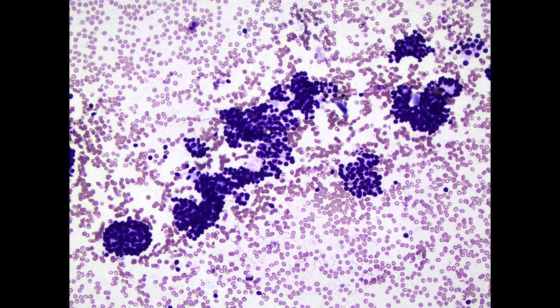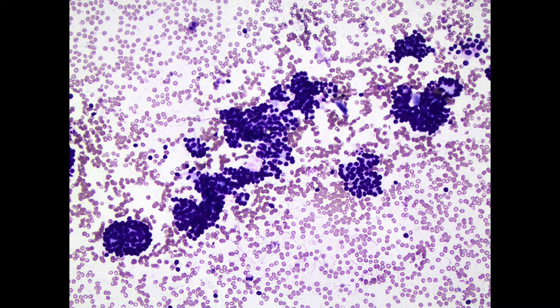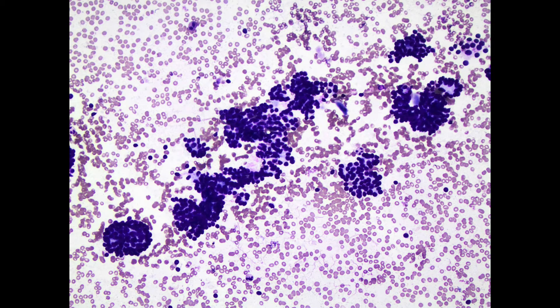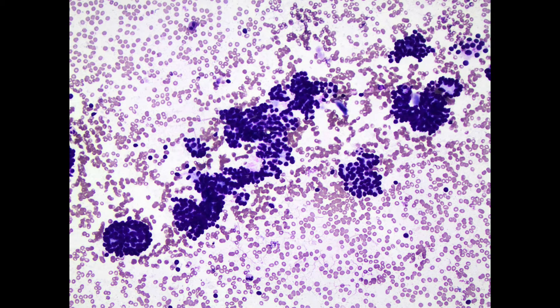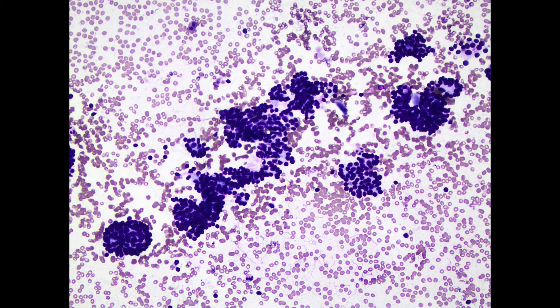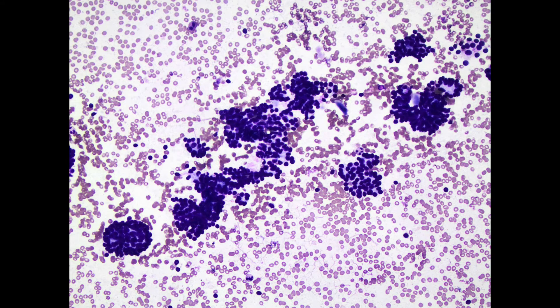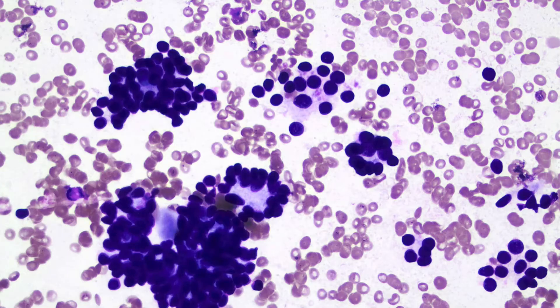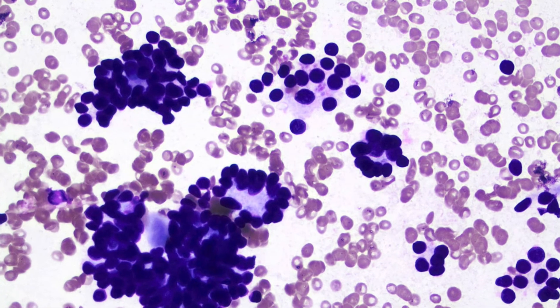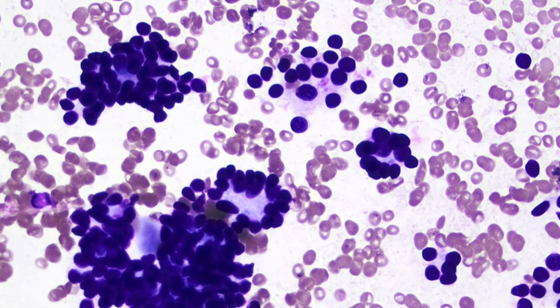Besides the microfollicular pattern, the cells of follicular neoplasm may be present in cords and ribbons with significant cellular crowding and overlapping, as you see on this image. This high power image demonstrates cellular crowding and some microfollicles.